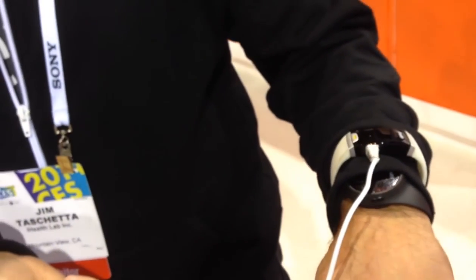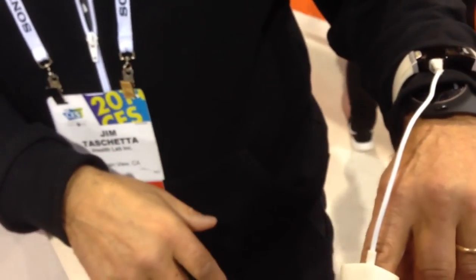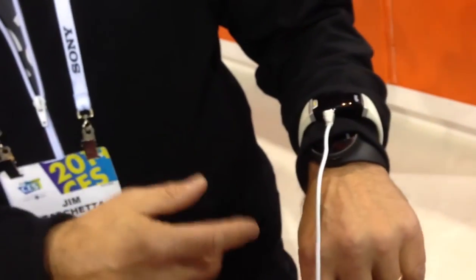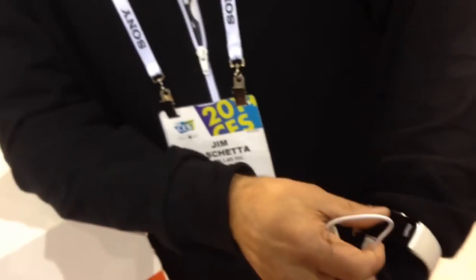It'll automatically wirelessly transmit to your device, which could be a mobile phone, smartphone, or tablet. This model doesn't have those other things built in, but we do everything from blood pressure to blood glucose monitoring. We also do sleep tracking and activity tracking, so we have all the technologies that we can incorporate into devices.